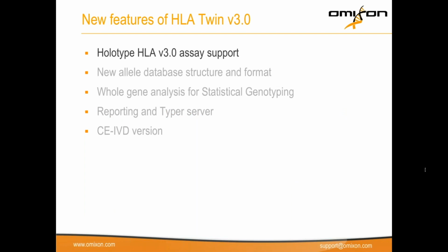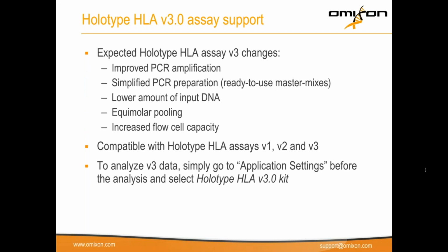Thank you, Effie, for the nice introduction and for introducing me. So good afternoon, everybody, again. As you probably know from our website, we are going to release a new version of our Holotype kit, version 3. And for that purpose, the new HLA Twin 3.0 has been developed. But let me first briefly describe you the upcoming changes in the new Holotype HLA kit v3.